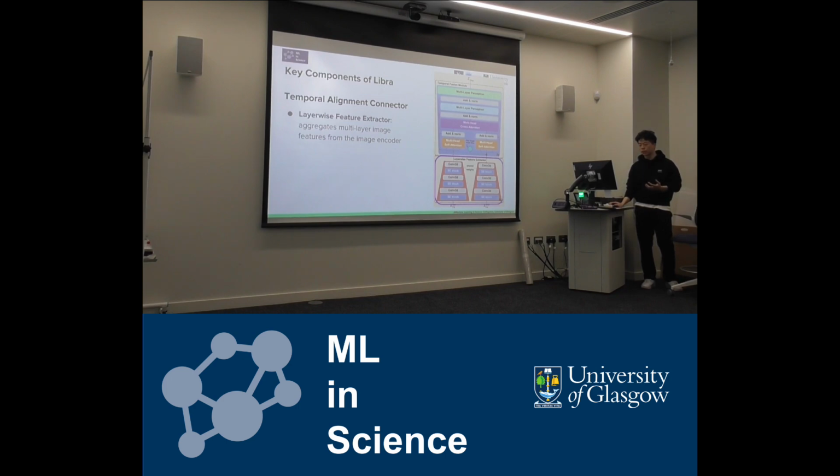Here we're treating the different layers as channels, progressively compressing them from the 12 layers to a single one, just using a simple convolutional network for downsampling. The first stage gives us a fine-grained representation for each image: the current image, the previous image, and possibly the dummy pair image.